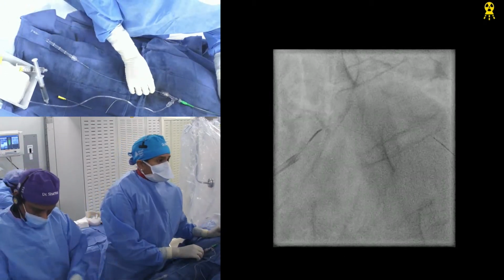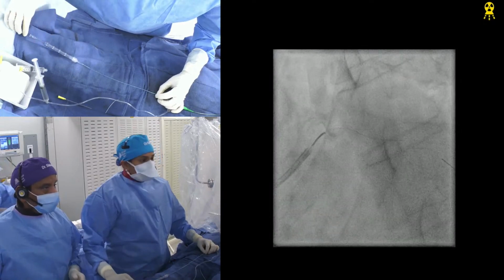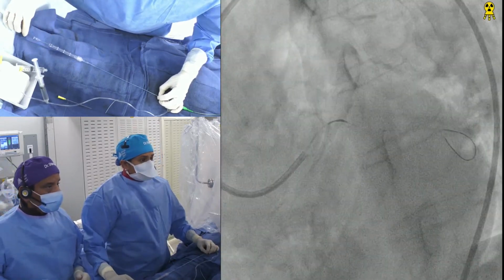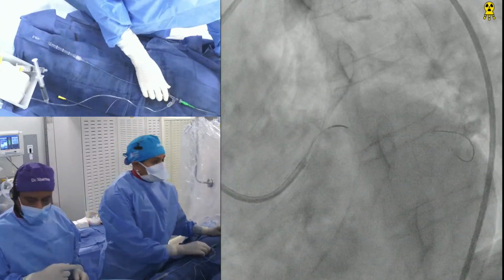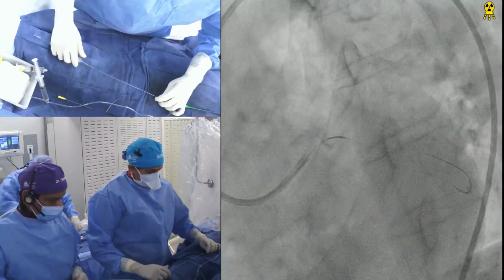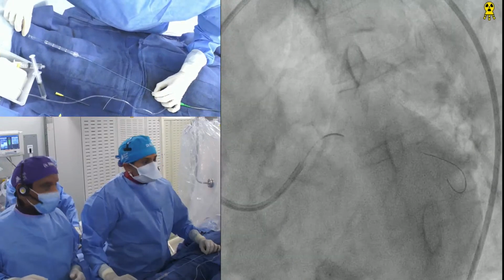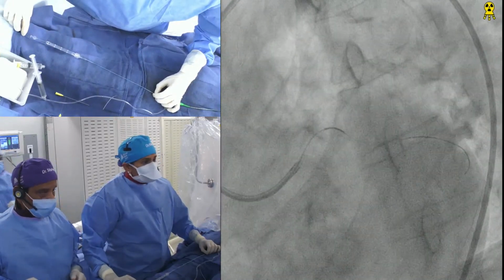So you see why it was different. It is definitely your venture, which is stiffer and kept the curve. It will be difficult to advance anything now. But let's see. You could hear the audience clapping, unbelievable. Immediately, several of them have jumped on. Excellent, excellent.